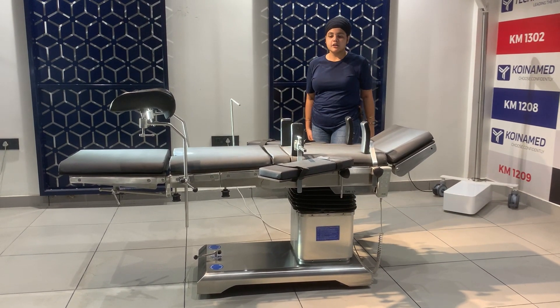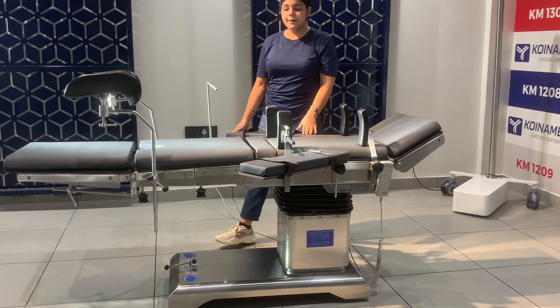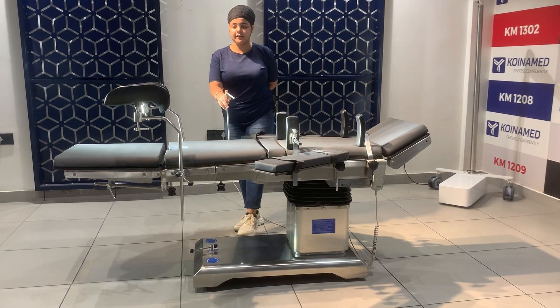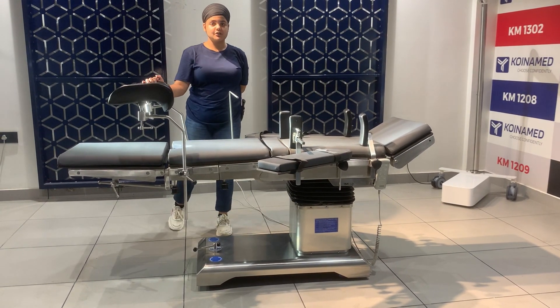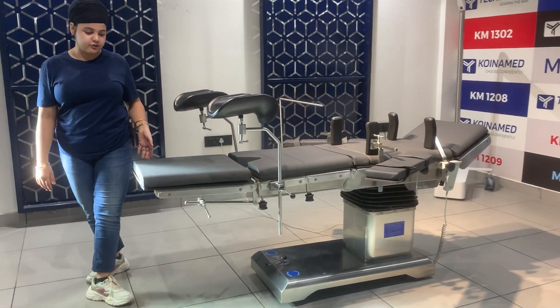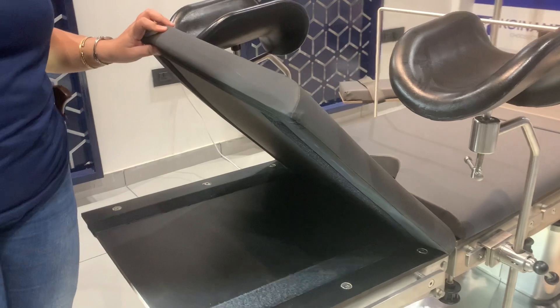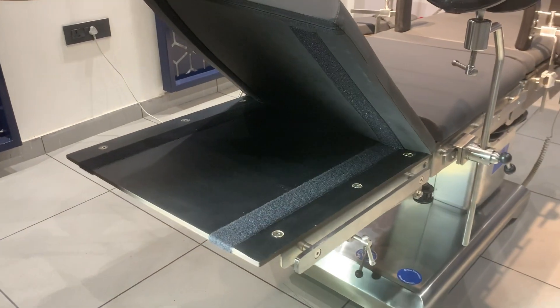This table also has standard accessories: the shoulder support, lateral support, armrest, anesthesia screen, and leg cover attachments. The table has high-quality foam mattress that is detachable from the tabletop, and we have a radiolucent top.